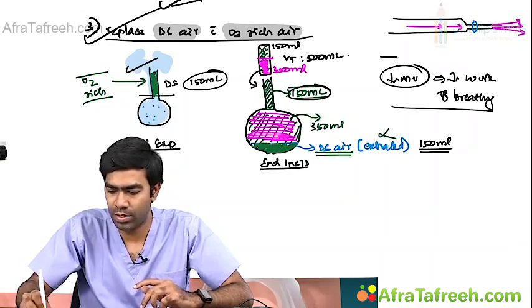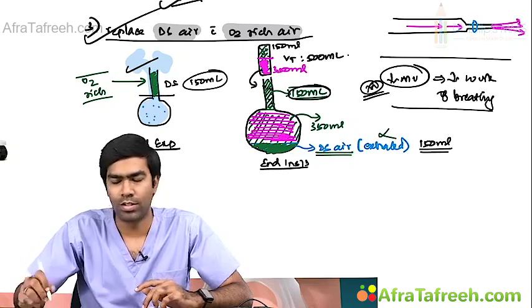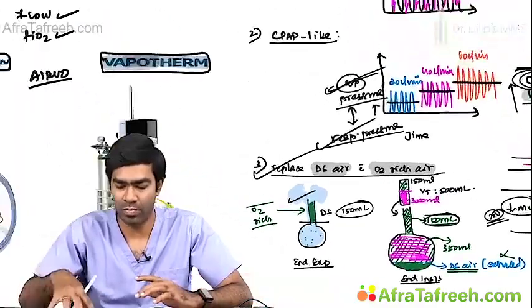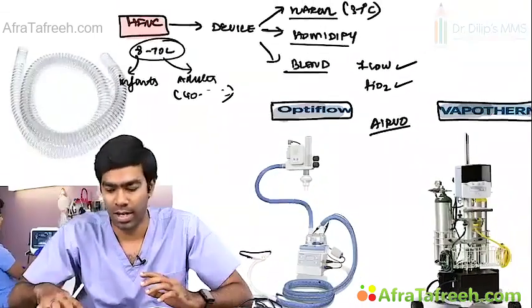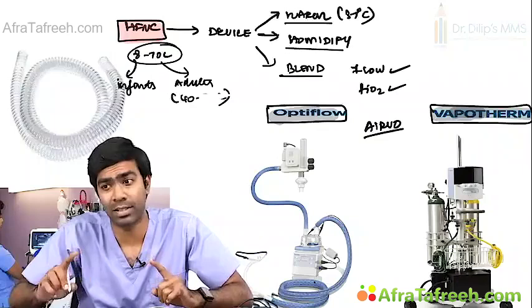This will definitely reduce the work of breathing also. Very, very important point. So that is the reason why whenever you give a high flow nasal cannula, the patients who are very, very sick may look very nice. They'll be extremely comfortable with the high flow nasal cannula. And that might be a false notion also, because appearances are deceptive.